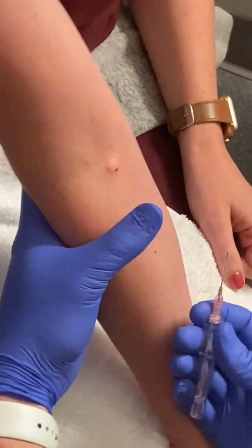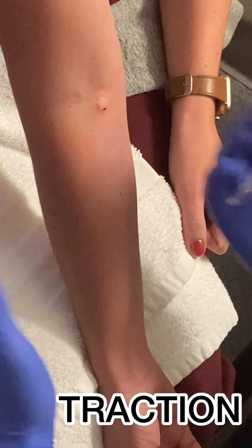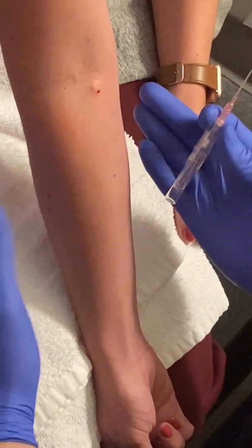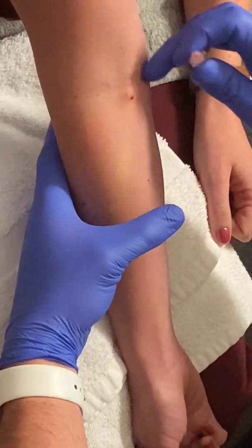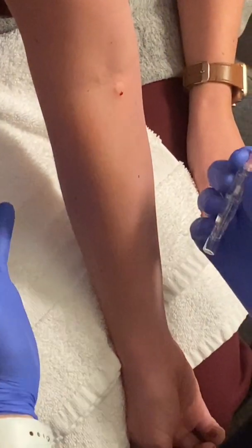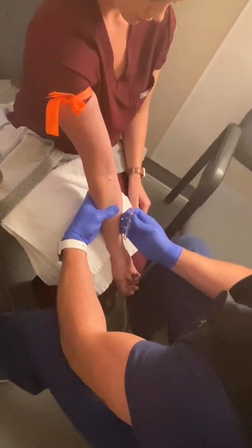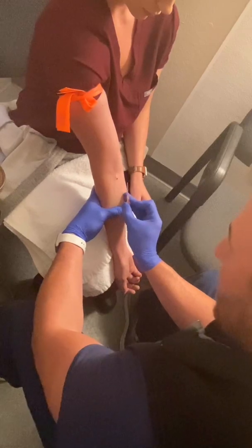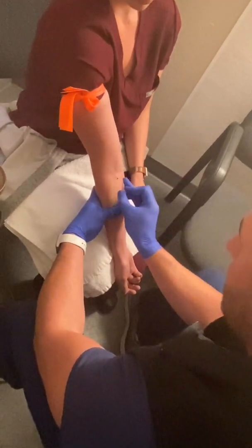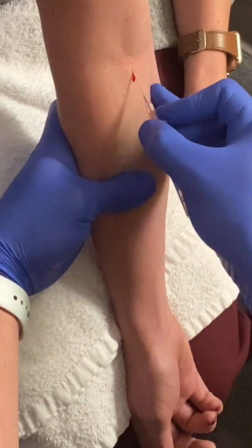Once again, get the arm hyperextended. The most important thing with an IV that I tell everyone is traction, traction, traction. If you don't have good traction, the vein will move around everywhere. So as long as you have great traction, you can do it this way. Some people do it that way. I tend to go at a lower angle here and hold it down tight. But that's the most important thing, traction, traction, traction. When you do your IV, go right in the middle of that lidocaine.